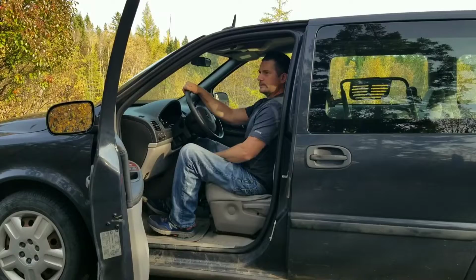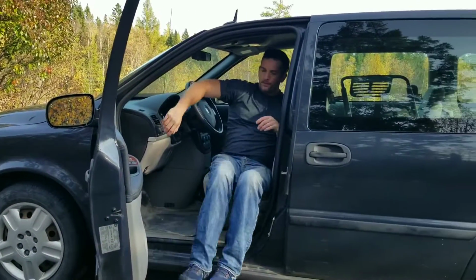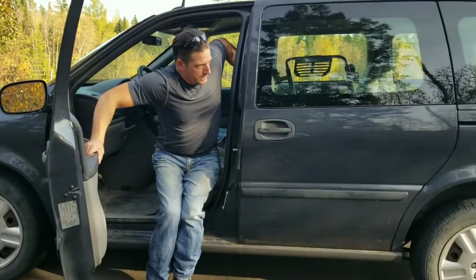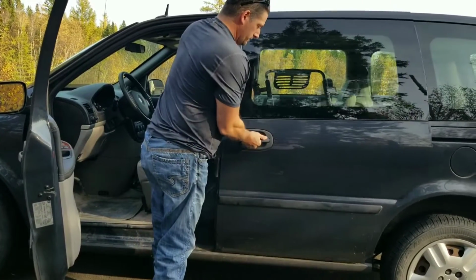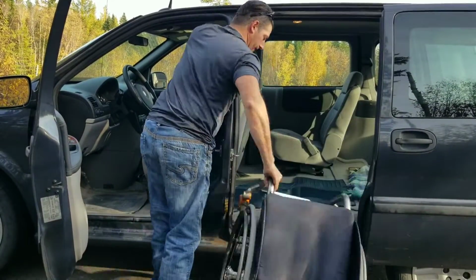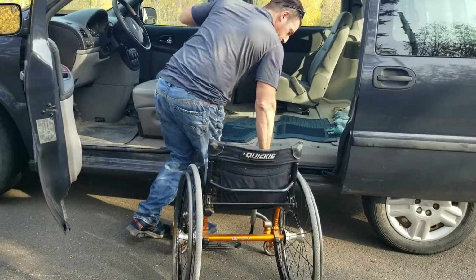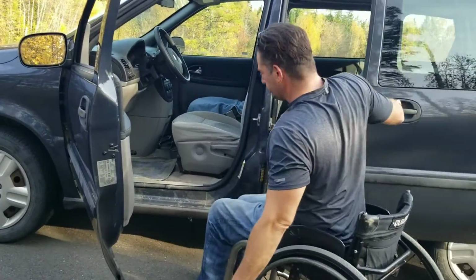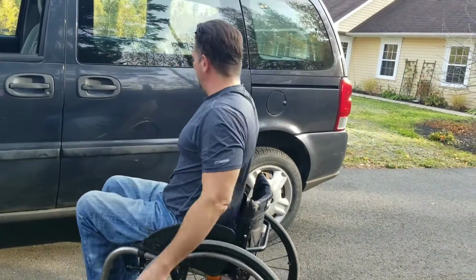To get out, it's pretty slick. It's just as easy. Pivot around. Grab the door for my balance. Push myself up. Open. Bring the chair out. Now I don't put my brakes on, but I'm holding on to the chair, so it's not going to go anywhere. I'll just let myself down into the chair. There we go.